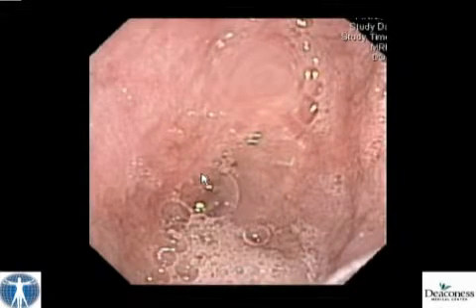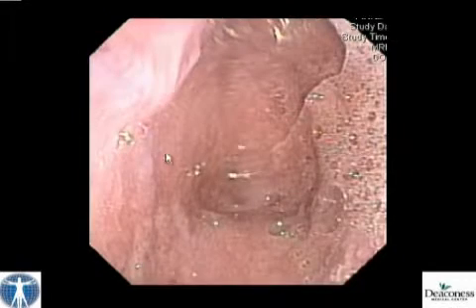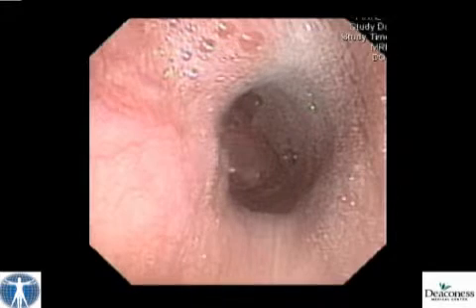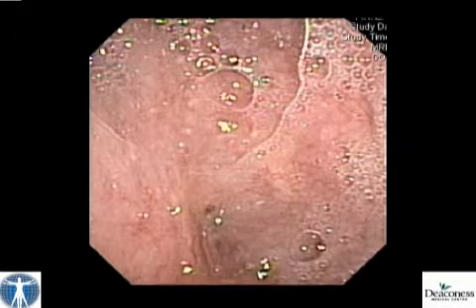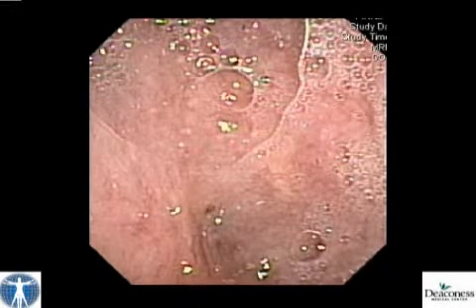A subsequent peroral endoscopy showed a dilated upper esophagus which is completely obstructed at the level of the mid-esophagus. Instead of tumor, a smooth epithelialized surface is seen. We then examined the esophagus from below using the gastrostomy tube stoma for entry into the stomach. The situation from below was similar. No tumor, but a blind end with a smooth surface was encountered.